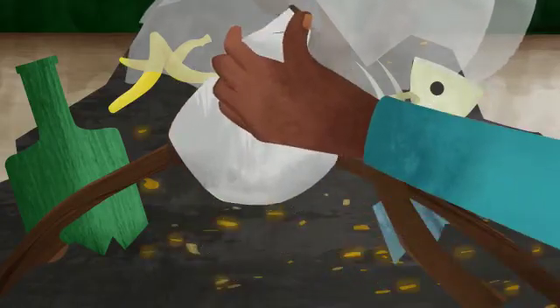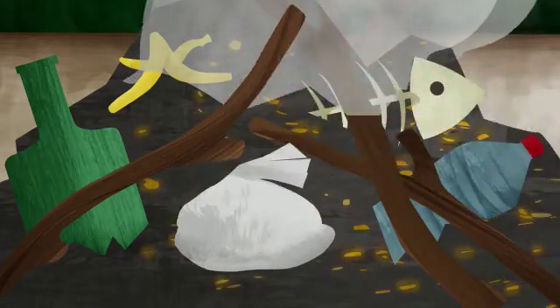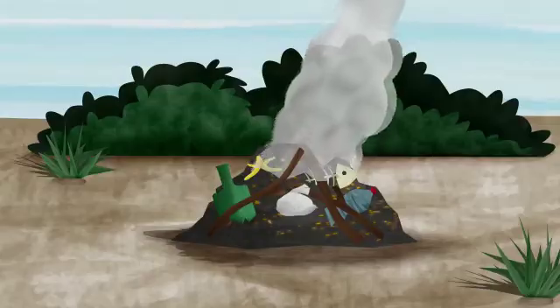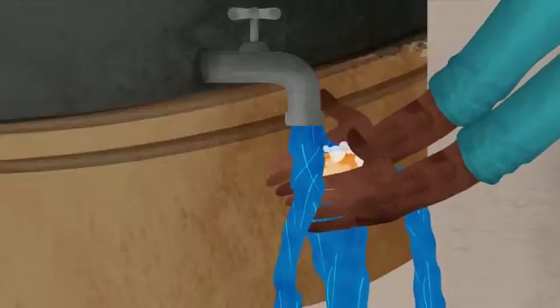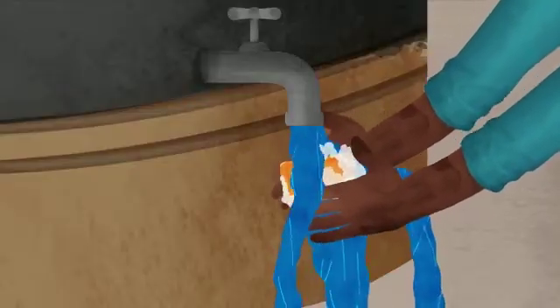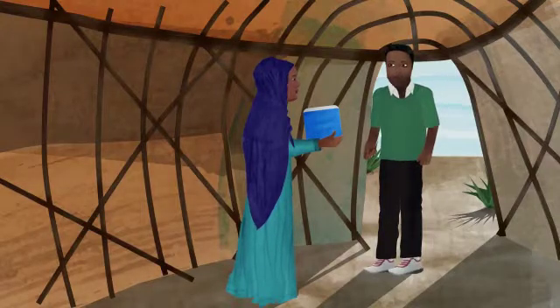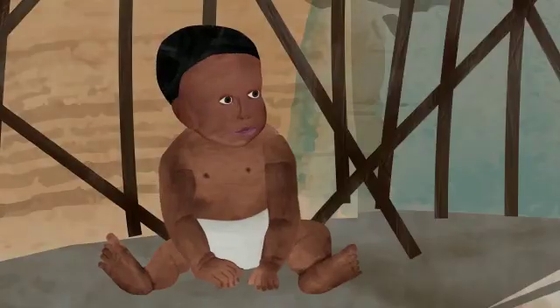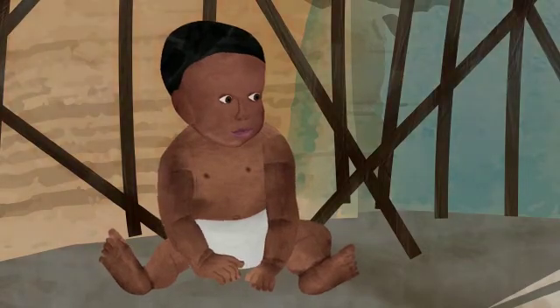It is important to dispose of the plastic sheet that you used to collect the stool, because it may still carry harmful germs. Carefully wrap up the plastic sheet and dispose of it, then wash your hands thoroughly with soap and water. Surveillance staff will take the sample to a secure place where it can be kept cold, and will return after 24 hours to collect a second sample.